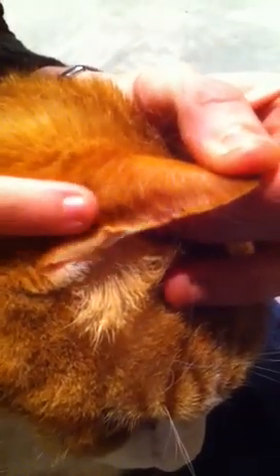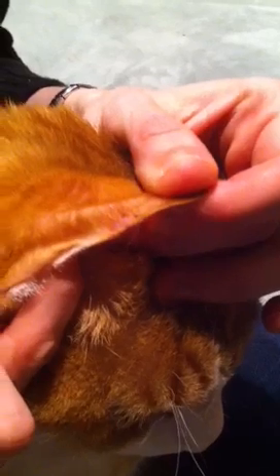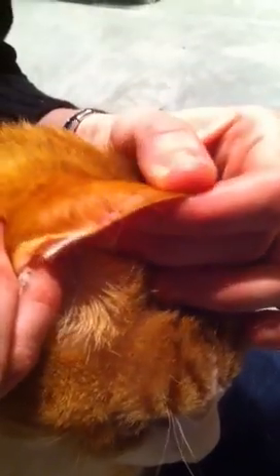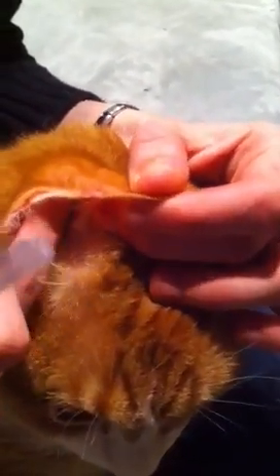If you go along the edge of the ear — my assistant Nicole is going to point just anywhere along that edge — even if you get it wrong the first time occasionally, you will start to get the feel for the tiny little distance from the very edge where, when you poke the needle in, you're going to get blood. You do not have to see the vein.